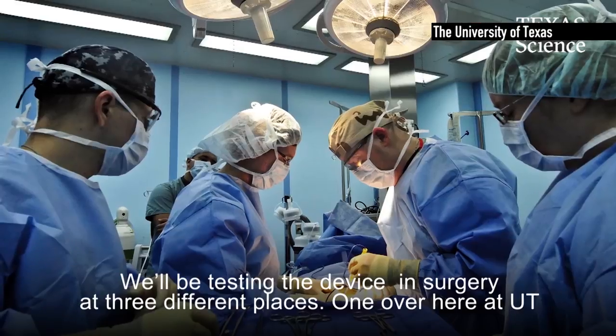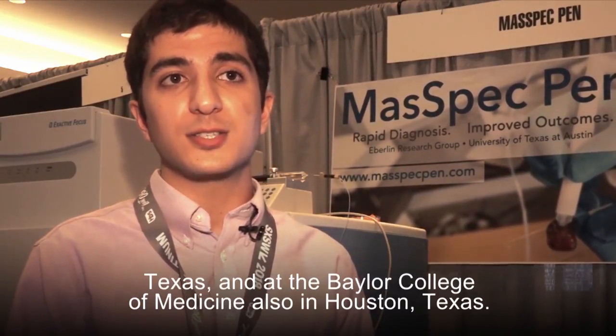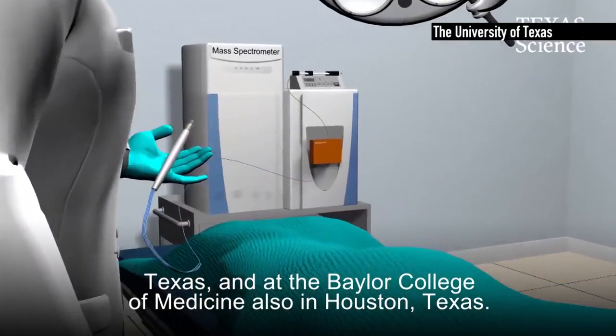We'll be testing the device in surgery at three different places: here at UT Austin at the Dell Medical School, at MD Anderson Cancer Center in Houston, Texas, and at the Baylor College of Medicine, also in Houston, Texas.